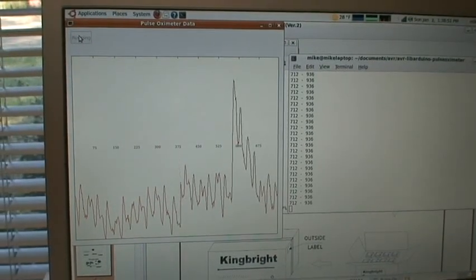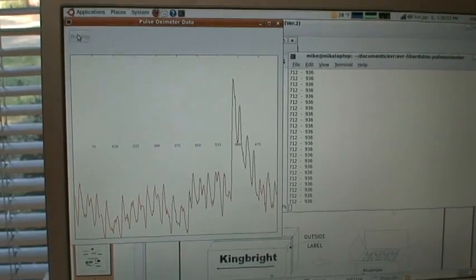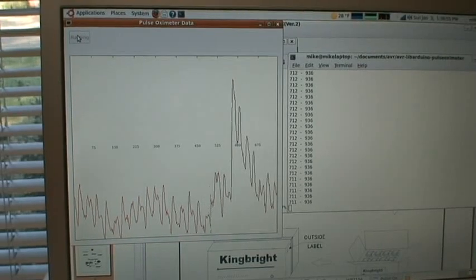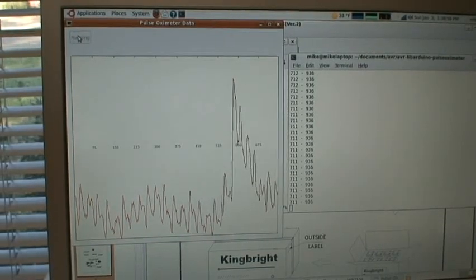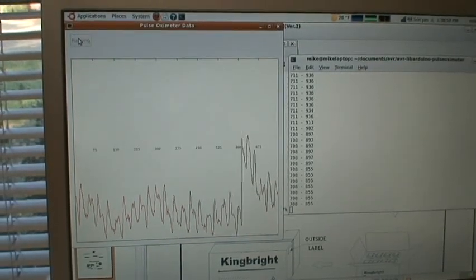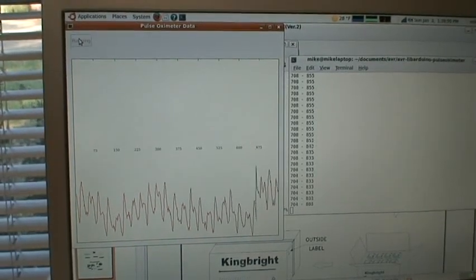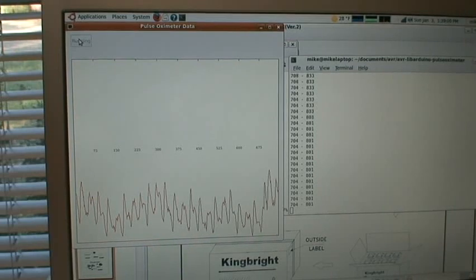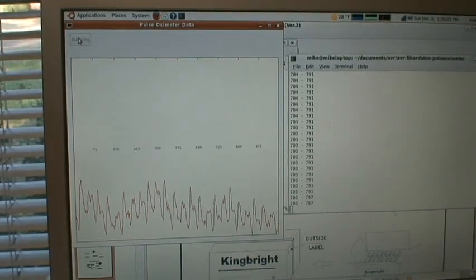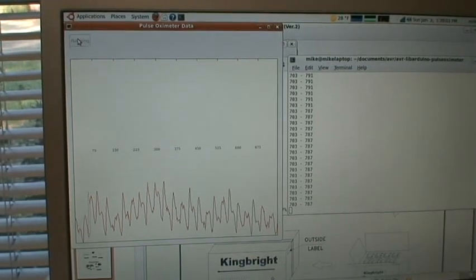So what you're looking at right now is a graph of the light absorption from a red LED. As you can see, as my heart pumps blood through my body and into my finger, you can see that change over time and you can see my heartbeat.